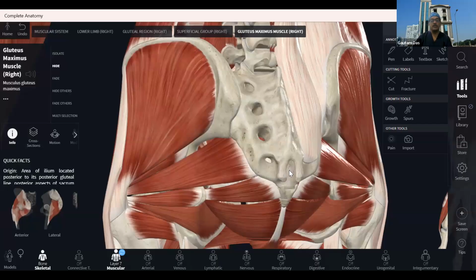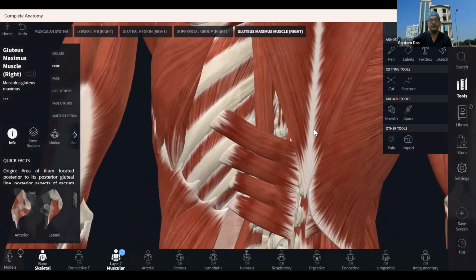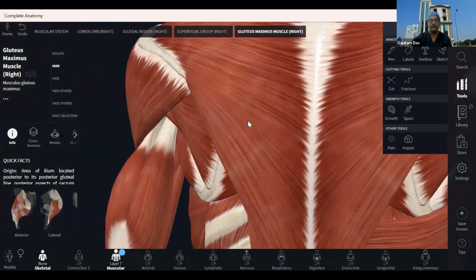Okay, so up to this, if you have any question, if you want to see anything in this anatomy, I can show you again, and then I'll be going for the, okay, thoracic muscles, a little bit complicated. Shall I repeat once again?